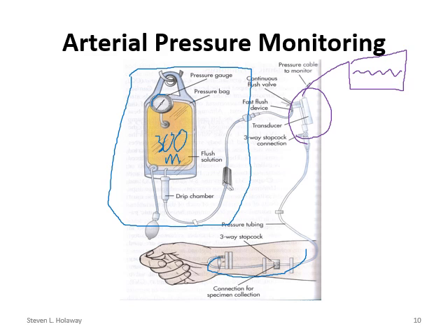Some will have a dial like this. Others will have a little device that hangs down and will come out and have little markings on it, and it'll tell you what the pressure is in the line. So it depends on which one you're looking at. But our responsibility as nurses is to make sure this never runs out of fluid, that we don't get air into the system, that we maintain it at the proper pressure. Those are our things. Now we'll talk a little bit later about these transducers.